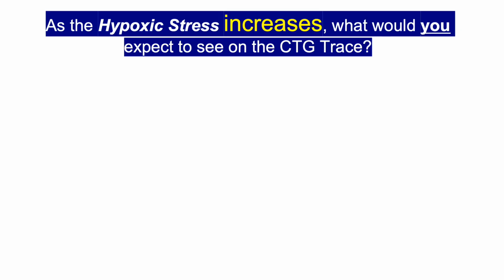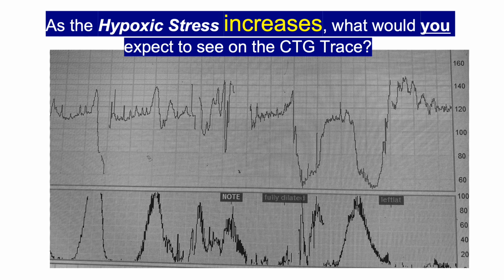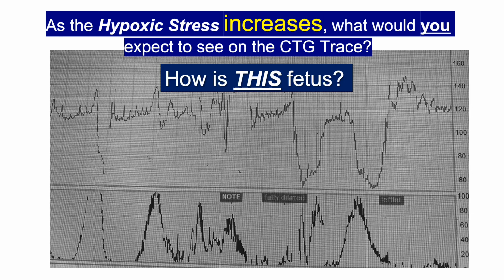So if the oxytocin level is increased and the fetus is going to have worsening hypoxic stress, what would you expect to see? Just like in the gym, as we go faster and faster, our respiratory rate becomes deeper. In the same way, as the uterine contractions or the hypoxic stress gets worse, you can see here that decelerations are becoming progressively wider and deeper.